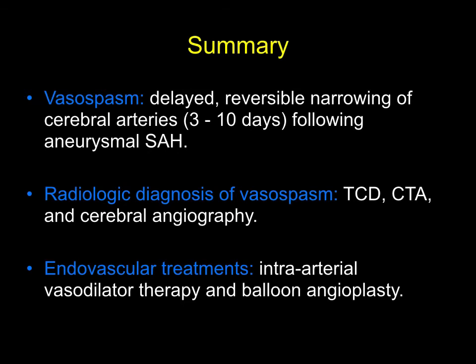In summary, vasospasm refers to the delayed, reversible narrowing of the cerebral arteries that typically occurs following aneurysmal subarachnoid hemorrhage. The radiologic diagnosis of vasospasm includes ultrasound, CT, and conventional cerebral angiography. Endovascular treatment options for symptomatic vasospasm include both intraarterial vasodilator therapy and balloon angioplasty.